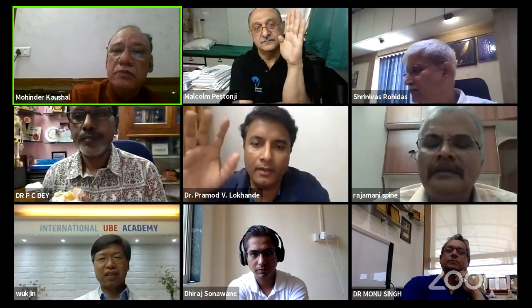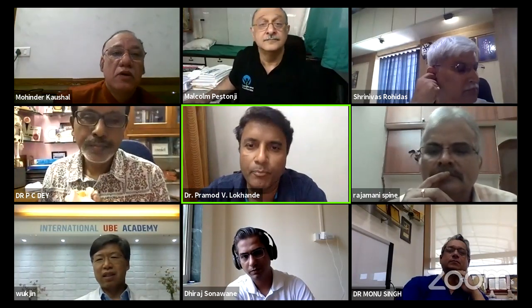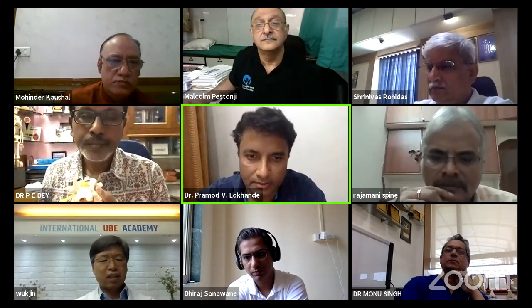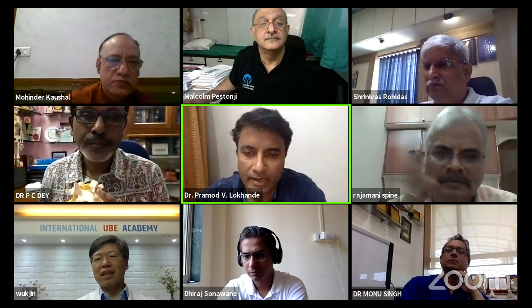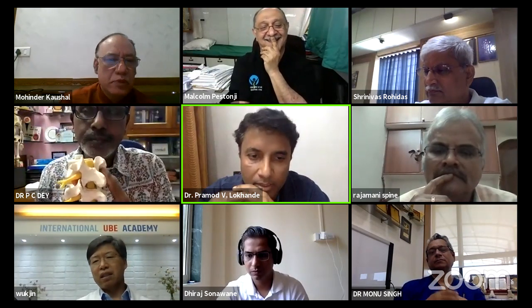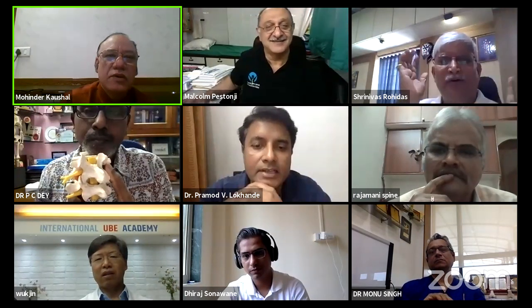Pramod, you like to come in, Pramod? Yeah, that is what I was telling, that you are telling the same message which I am telling in different words. You are going lateral to the facet, lateral border of the isthmus, which is similar to a transforaminal approach. So only same, you can reach posteriorly. That is what Pramod was telling you. The interlaminar approach is something which is in between the interlaminar space. That is the interlaminar approach. And don't confuse the words.